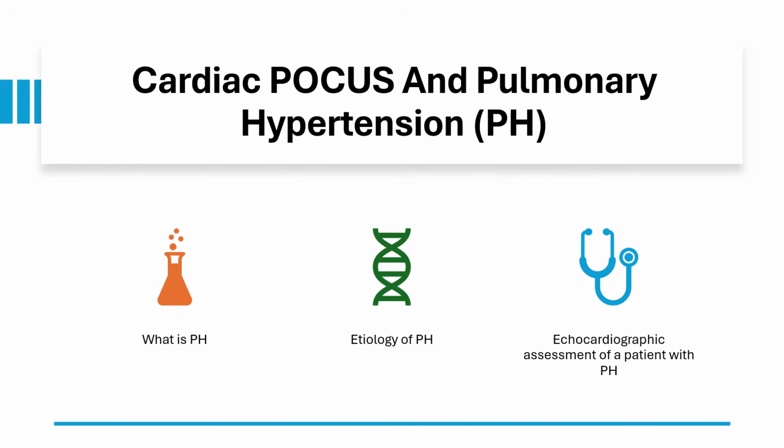All right, let's switch gears and talk about cardiac point of care ultrasound in pulmonary hypertension. In order to understand this important concept, first we'll have to describe what is pulmonary hypertension, review its etiology, and then we'll follow by echocardiographic assessment of a patient with pulmonary hypertension.